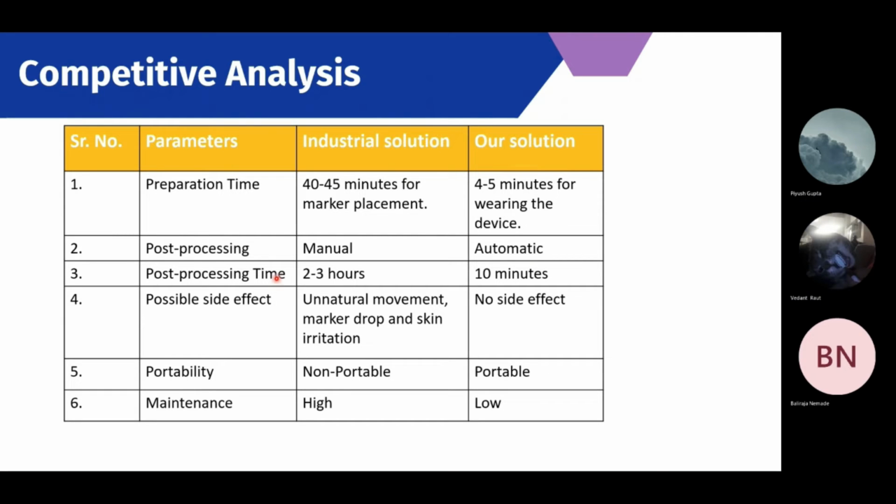Coming to the possible side effects, the marker-based mocap system requires glue to be stuck on your skin, so it can cause skin irritation and unnatural movement, and markers can drop, whereas our solution has no side effects.